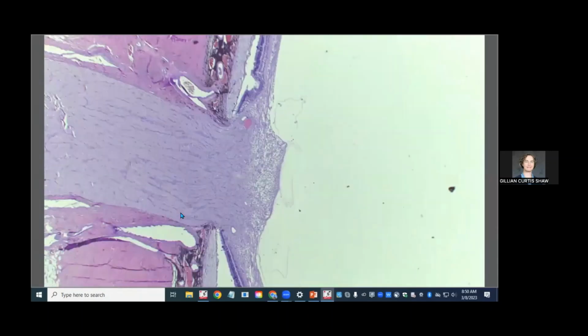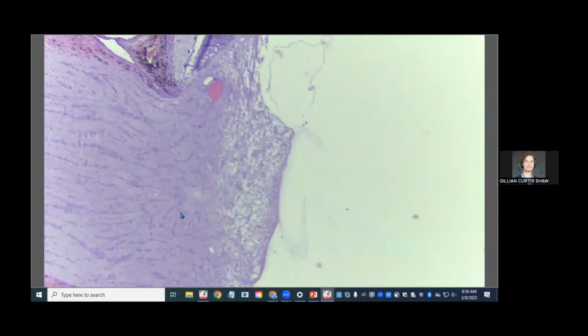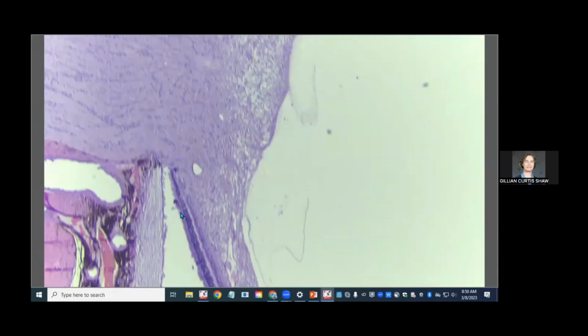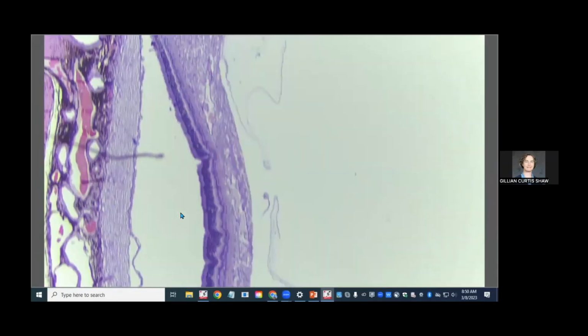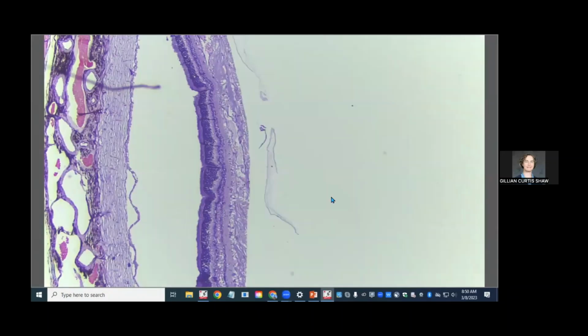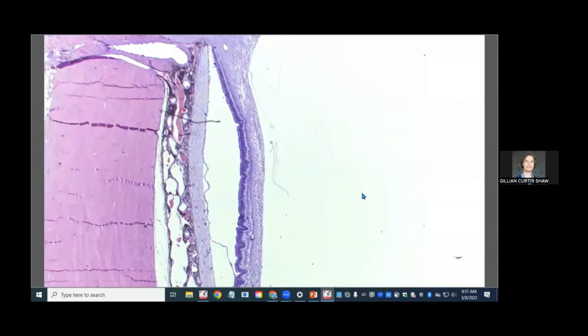There aren't really any clear glaucomatous changes as we know them in a dog or a cat. The optic nerve looks reasonably okay. I think there's a good number of retinal ganglion cells, at least at our examined level. But it's tough to tell what glaucomatous lesions might look like in various species. We don't have a lot of well-defined histologic correlates for some of our more exotic species. And I think that's all I wanted to show you in this eye, briefly.